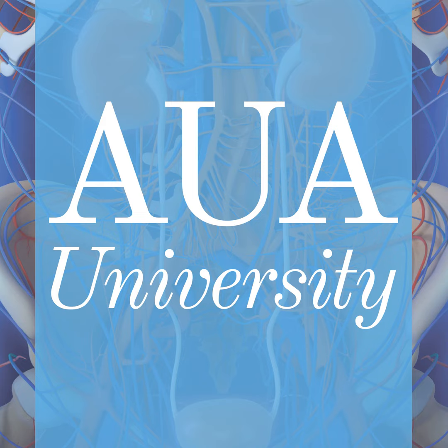Once again, in summary, PSMA imaging overall is superior to Axumin or conventional PET. PSMA PET CT has many applications in initial staging of intermediate and high-risk patients, cancer recurrence, as well as treatment decision-making. But it's really important that you have correlative CT or biopsy findings when you have a PSMA PET positive finding, especially if it's in an unusual location.